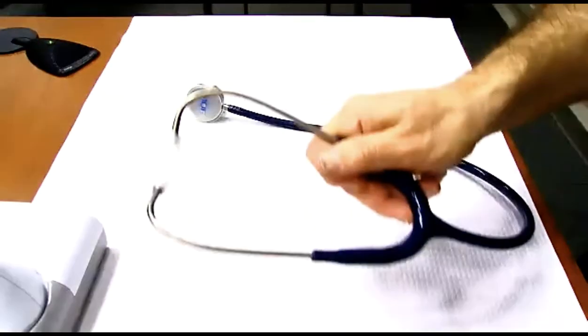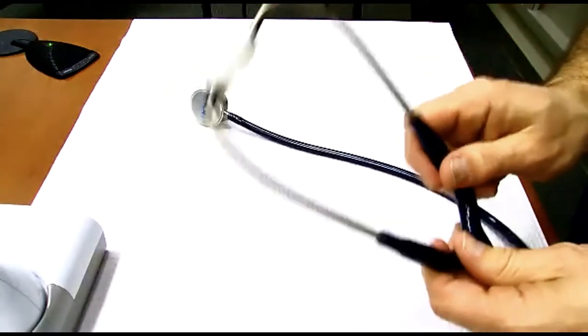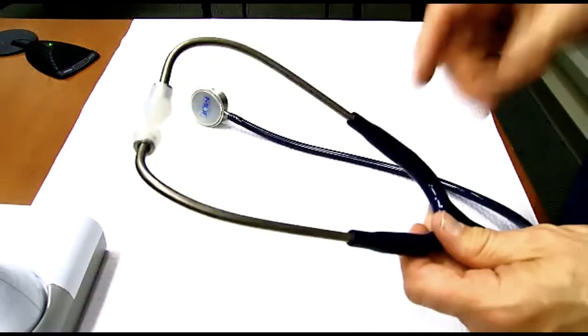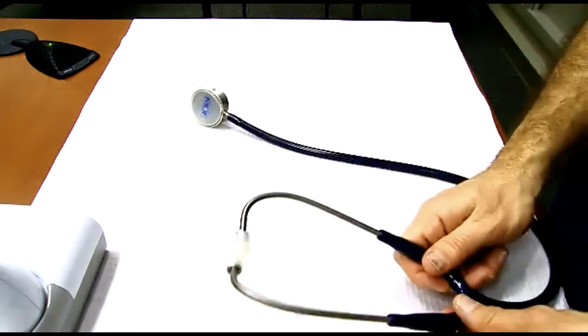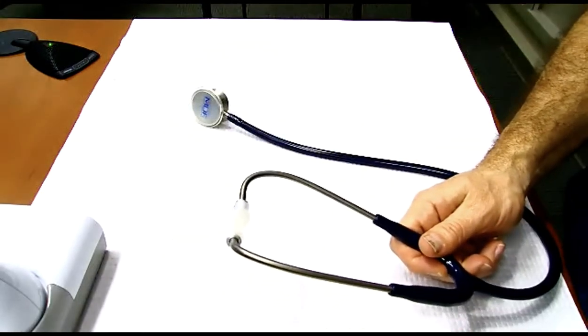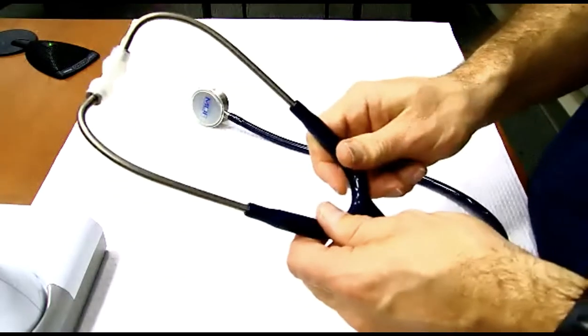The only other thing I would say about your stethoscope, so we got your earpieces and talked about the angle, is that they need to fit firmly in your ear. You don't want them loose and dangling, but you also don't want it so tight that it's pressing your ears and you can sometimes hear your own pulse. If it's too tight in your ear, you're going to hear your own pulse because it's squeezing your head.